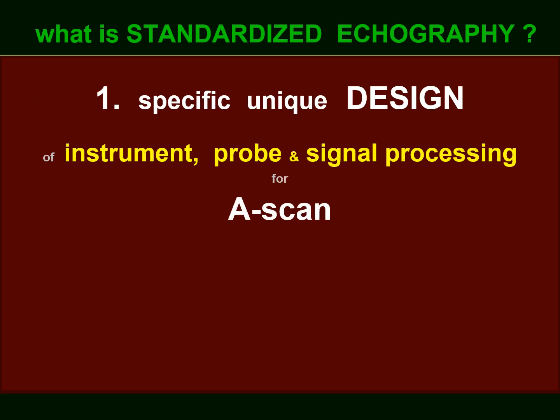And now the question, what is standardized echography? It has first a specific, unique design of instrument, probe, and signal processing for the standardized A-scan.